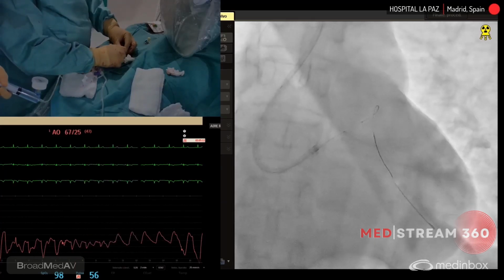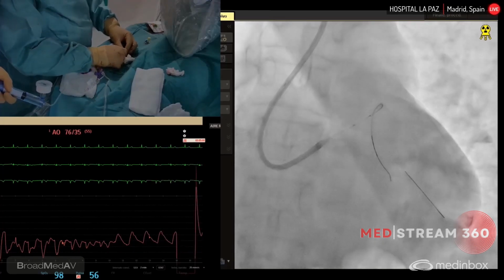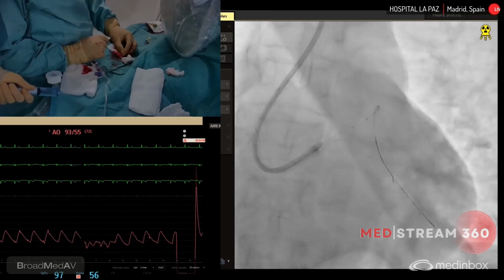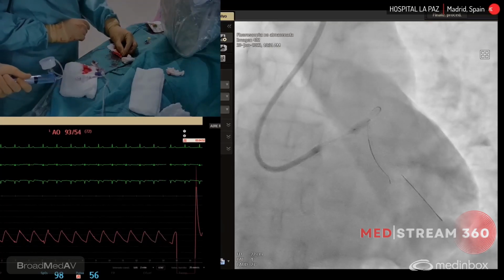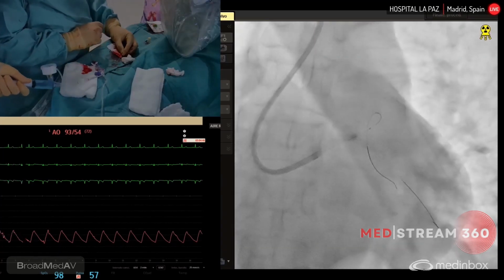I'm going to 10. There is some debate about the atmospheres you need to reach with the cutting balloon. To be honest, we use them probably in a similar way to a conventional NC balloon, but we are being more conservative today with 10. Higher, or is 10 okay? 10 is okay. The expansion is quite good. It's enough because the plaque is modified, no? Yes.